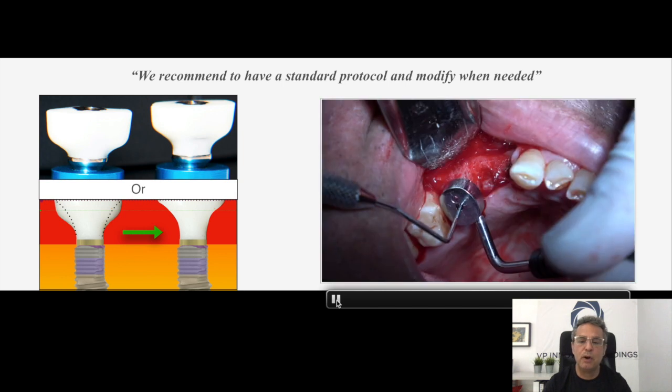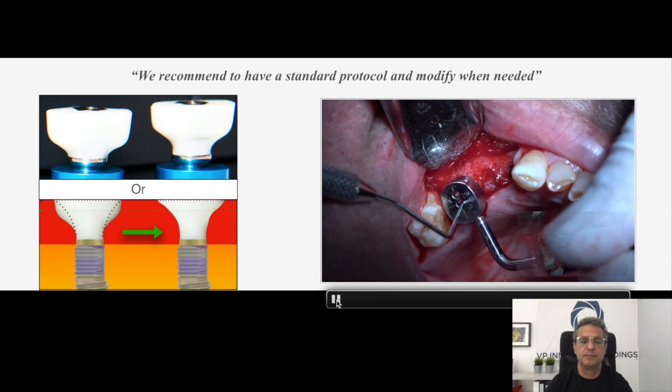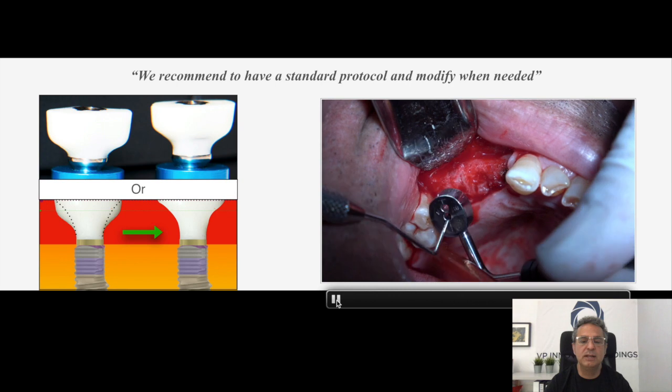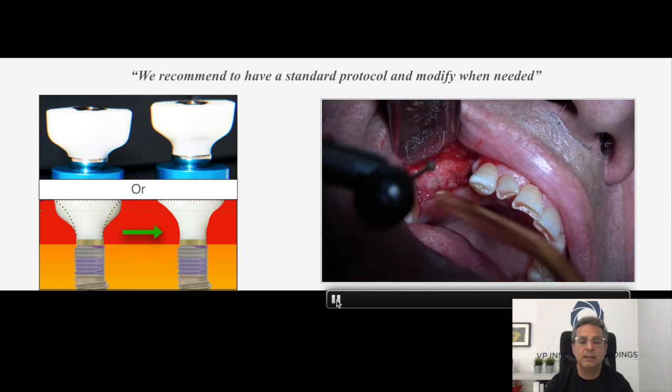He takes his probe, positions the tab on top because he has a plethora of information. He has all his old videos from the first surgery. He goes into this before he does the second surgery. He knows basically what he had done. So he puts the probe, puts the tab in position, and it gives him an understanding of where he was. So he doesn't have to remove too much bone. He just goes in and he finds the cover screw immediately.